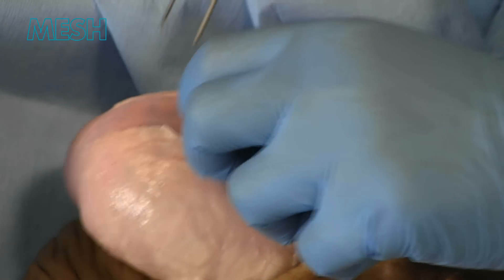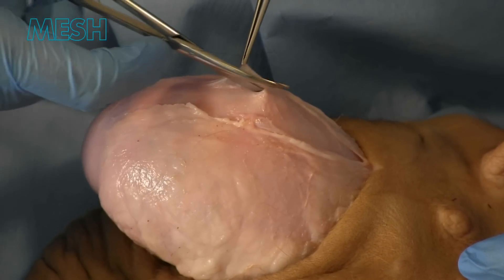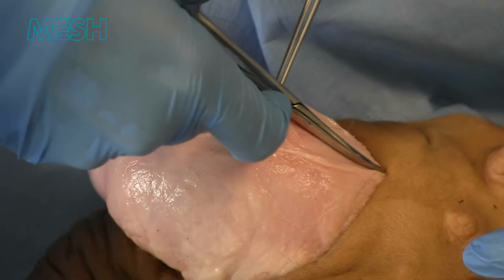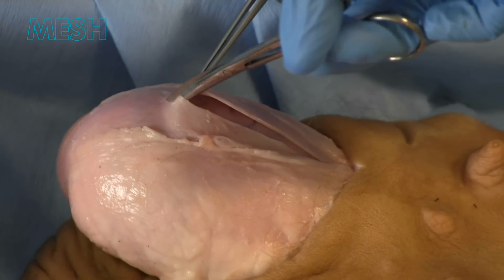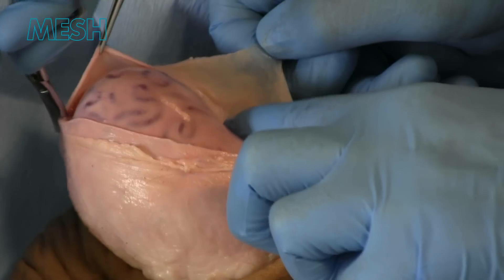With the hydrocele, on entering the correct plane, there will be fluid released at this point and you may need suction or a kidney dish to collect the fluid. We can see the lining of the testicle, the anterior border with tunica albuginea being revealed here.